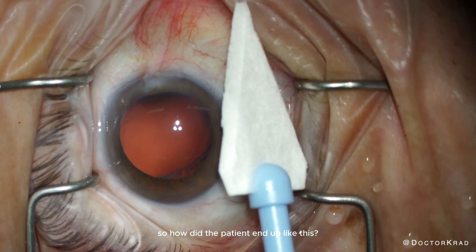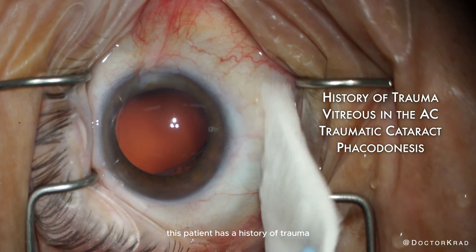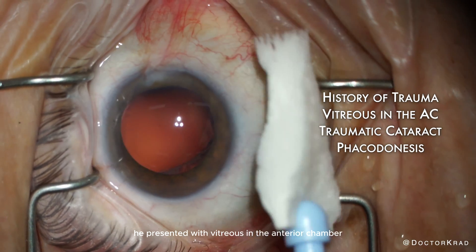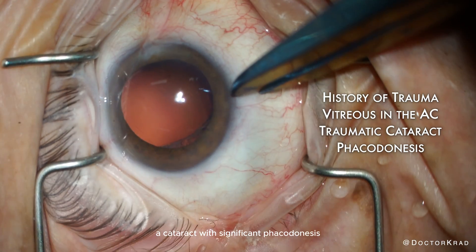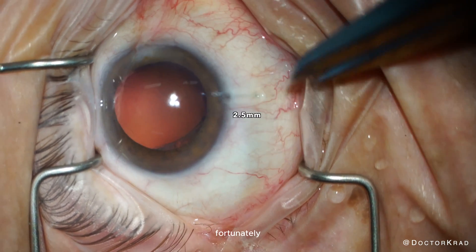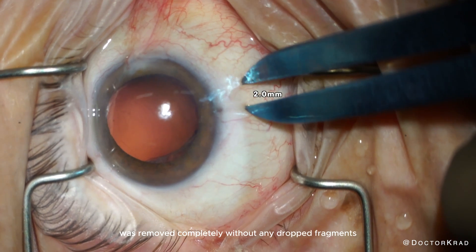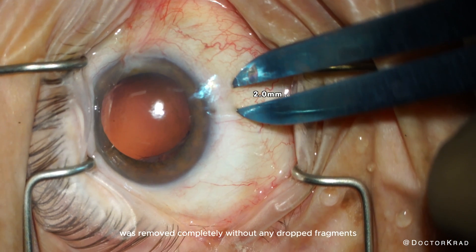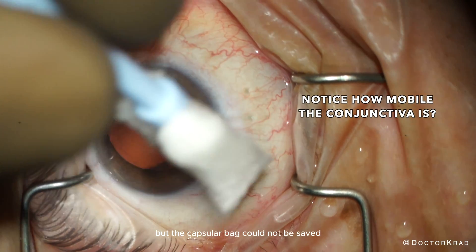So how did the patient end up like this? This patient has a history of trauma. He presented with vitreous in the anterior chamber, a cataract with significant phacodonesis, all from the lack of zonules. Fortunately, during his initial cataract surgery, the cataract was removed completely without any dropped fragments. Anterior vitrectomy was performed, but the capsular bag could not be saved.